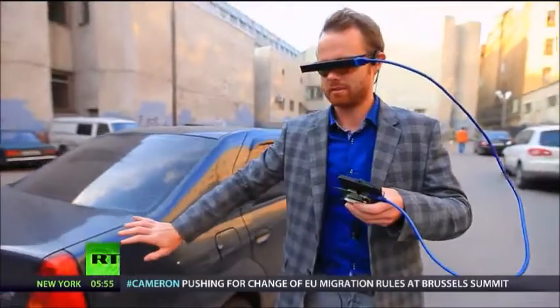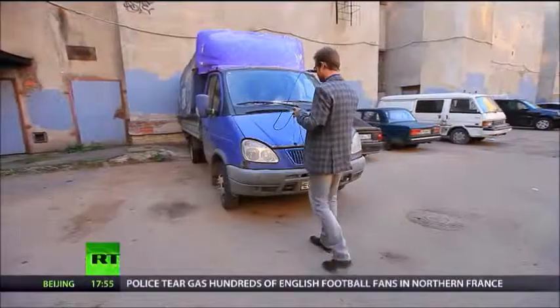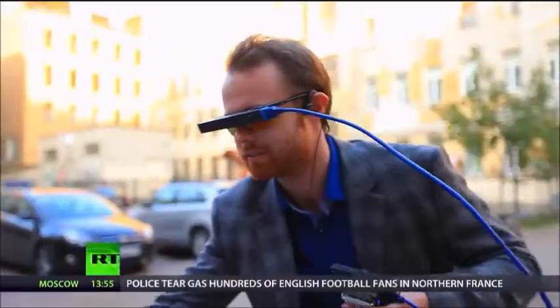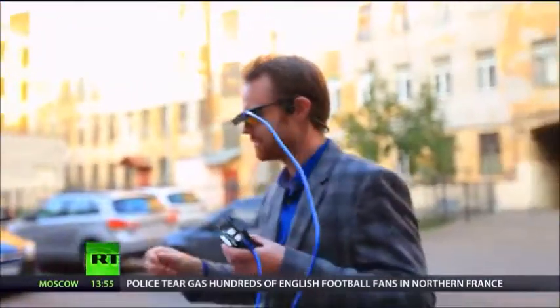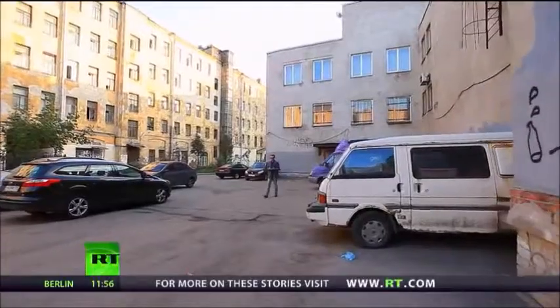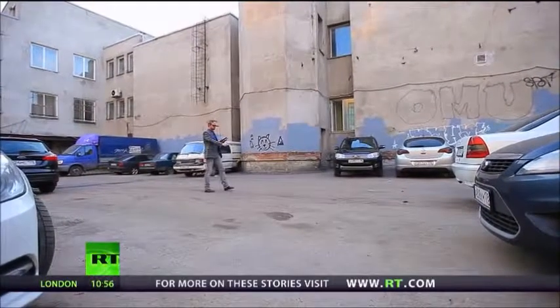The bone-conducting earphones were surprisingly effective and still left my ears open to hear what's going on around me. By pressing the remote, an ultra-fast simulated voice notified me of the distance of the nearest obstacle in front of me, but it had to be slowed down quite a bit for me to catch anything it was saying. The team are constantly refining pothole, curb and step algorithms.